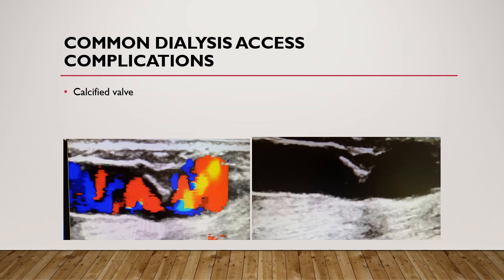This is a complication also likely to occur in dialysis fistula.